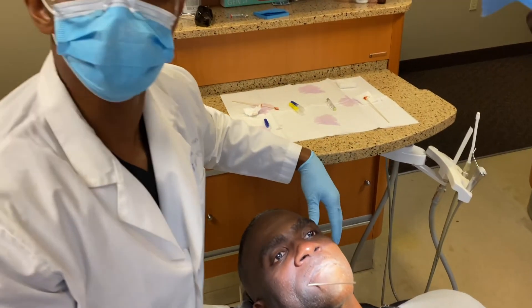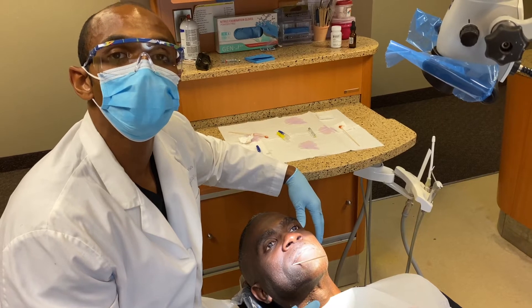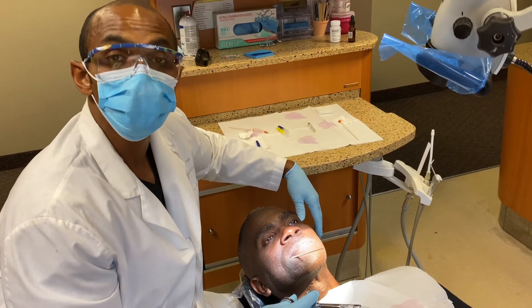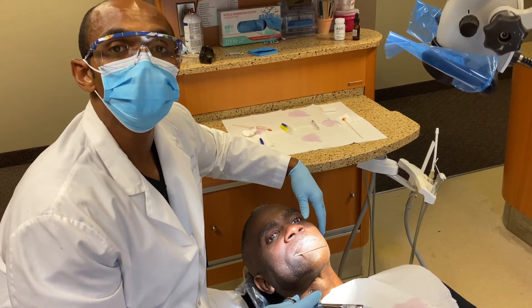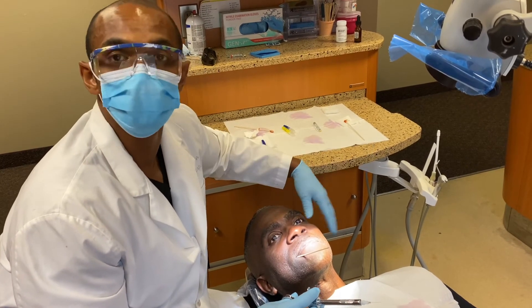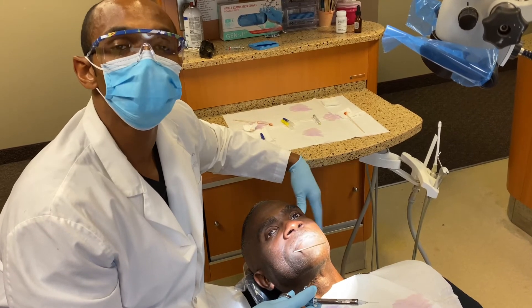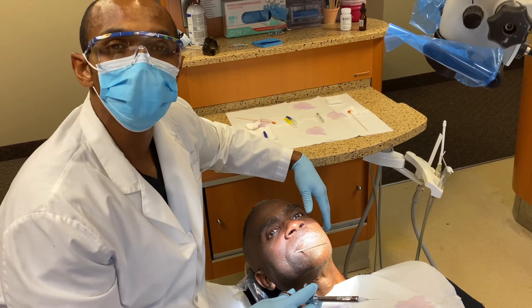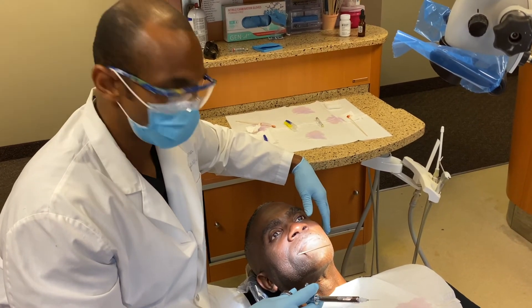In order to retract the soft tissue and make sure that you're being safe with your needle and not in jeopardy of having a needle stick, you can use a tongue depressor or a mouth mirror. I use my finger because I've been doing this for several years and I'm comfortable, but if you're not, I would recommend using a tongue depressor or a mouth mirror — something that keeps your fingers out of the way for the PSA injection.